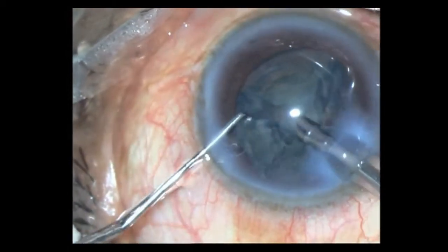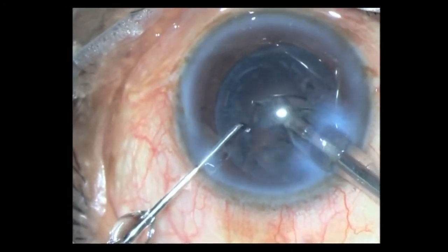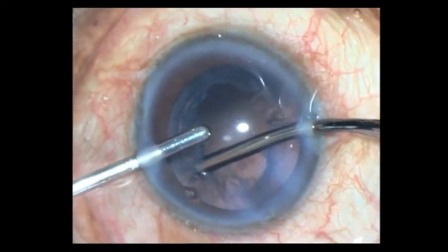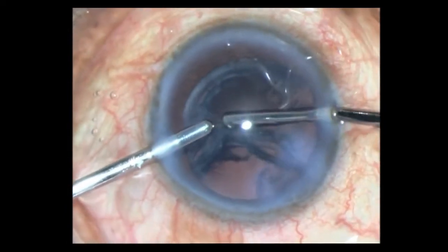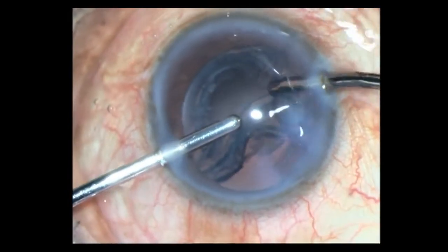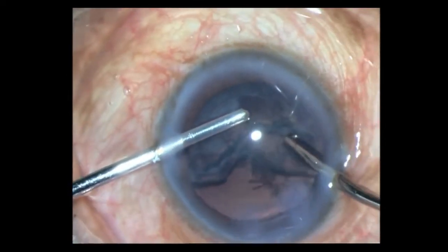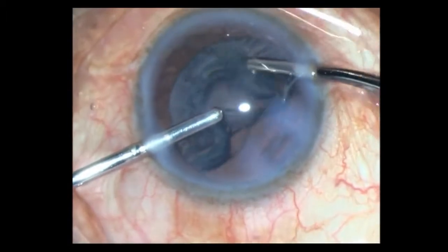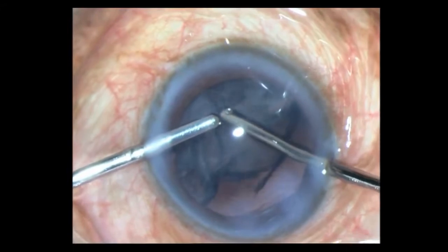The segments are coming out nicely. Once all of them are removed, I then switch to my bimanual and remove all the cortex. Parameters are much lower now — around 300mm vacuum and around 20 to 25ml flow rate. You have to occlude the tip and strip the cortex toward the center; don't take it out in bits and pieces — it's better to take it out in sheets.